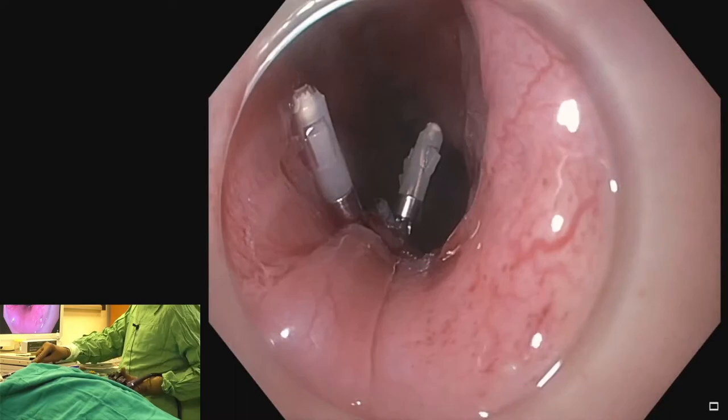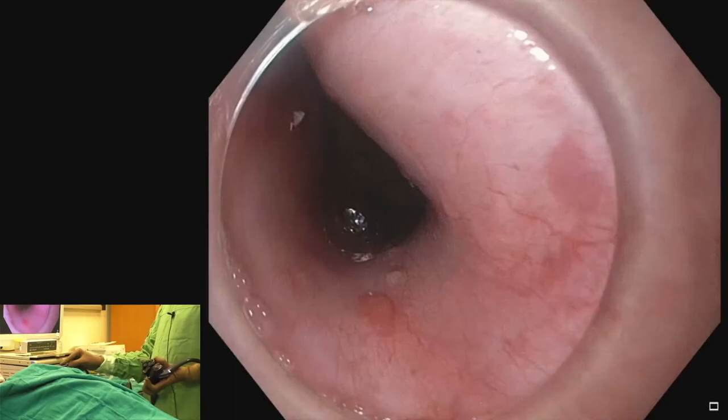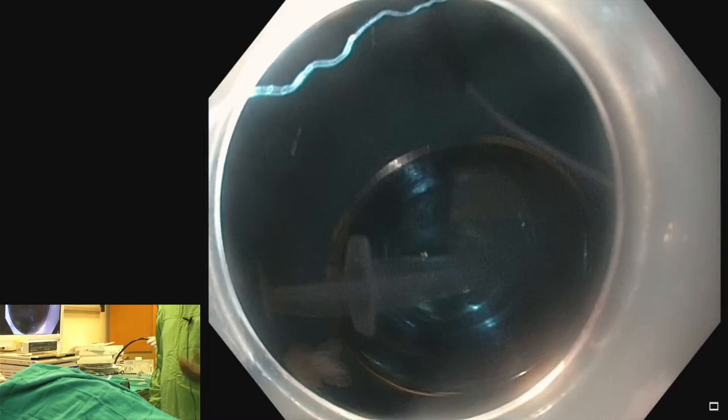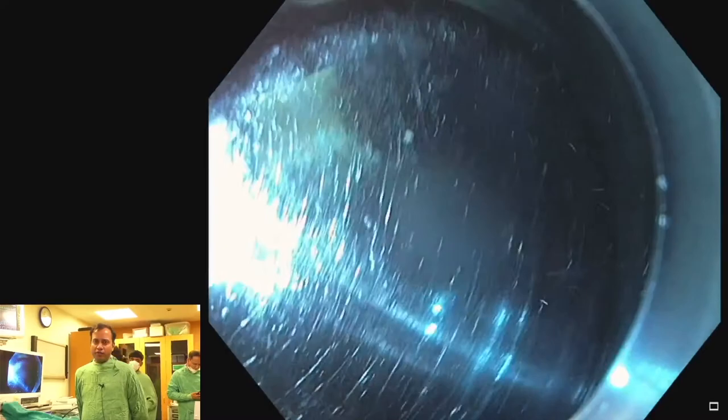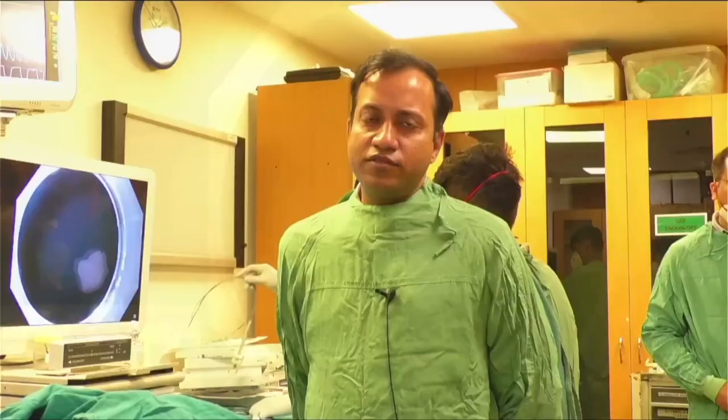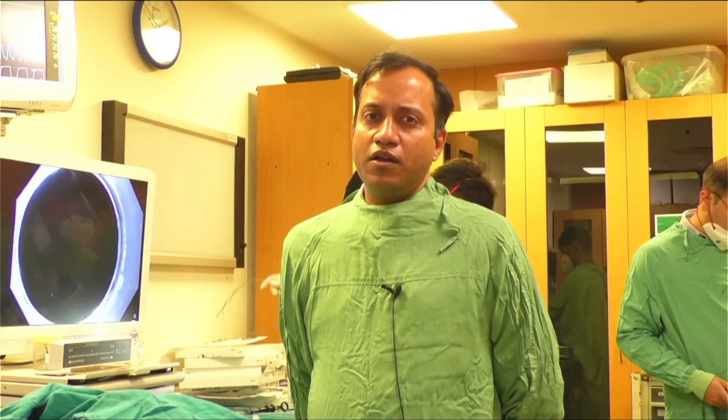We take out the scope. So that completes the POEM procedure. This patient will be extubated after around 5 minutes, and then we do the gastrografin study tomorrow in our endoscopy room. If there is no leakage of contrast inside the tunnel, then we can start the liquid diet tomorrow.